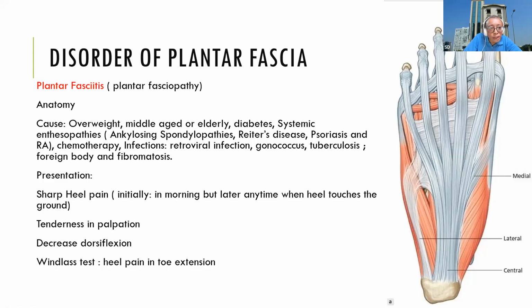As you may have noticed, our foot is not flat, it is slightly arched. This arch of the foot is maintained by the plantar fascia along with some other ligaments. Other supportive ligaments are the short and long plantar ligaments, which also help in maintaining this arch. But the main role in maintaining the arch of the foot is played by the plantar fascia.